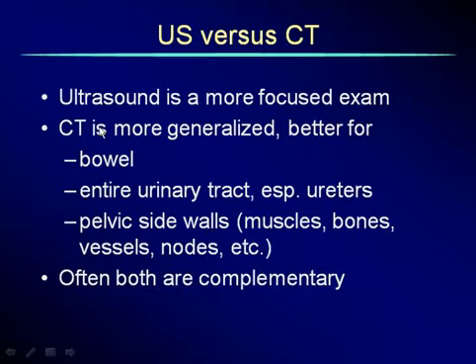Now, we all know that ultrasound is an excellent modality for evaluating the female pelvis. But what we're actually doing is we're focusing on pelvic organs. So it's more of a focused examination. When you look at CT, it has a broader scope of the structures that we can look at. It is used for more generalized types of evaluations.